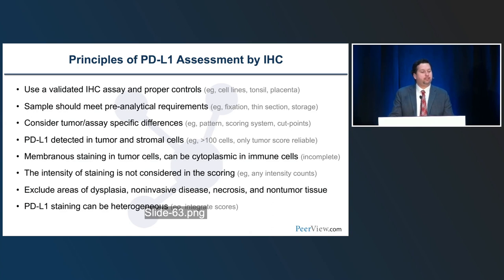A second important principle is that the sample should meet pre-analytical requirements. And this sounds obvious, but it's still a problem in some settings where samples are underfixed or overfixed, and that can compromise immunoreactivity or epitope recognition by the antibodies.